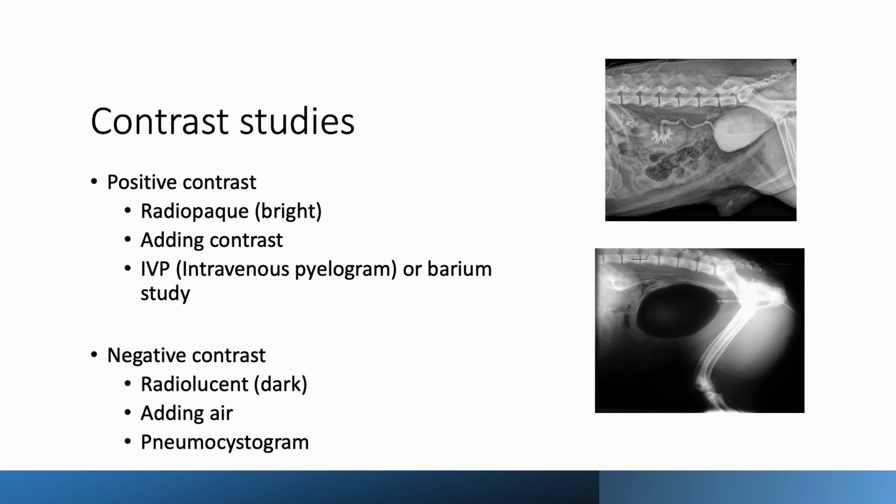Contrast studies are helpful when looking for something that can't be seen on a flat X-ray. Honestly, contrast studies have been replaced by ultrasound, so in practice, we're not doing very many contrast studies anymore. But this is still a potential area for questions on the VTNE, which is why we're reviewing it.